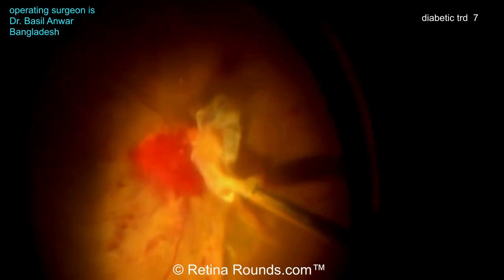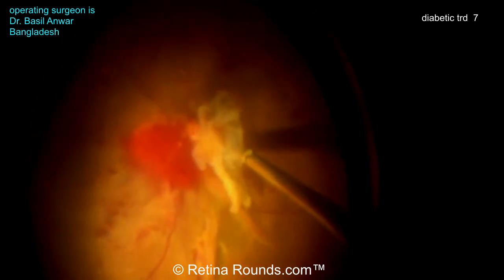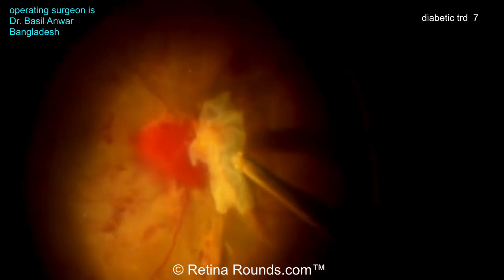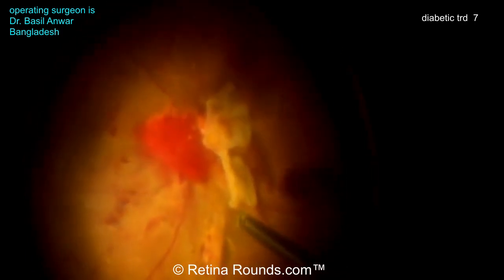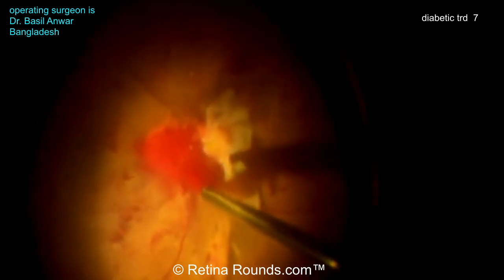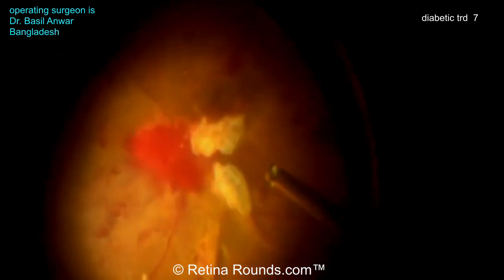Now using the cutter to segment: the membrane is loose in multiple areas, so he's using the cutter to debulk and break it down into smaller pieces. You can actually see the mouth of the cutter underneath that fibrovascular tissue — that's usually a very good sign that you can safely cut in this location. If you can see through a membrane through the cutter, you're probably not engaging retina. He's doing a nice job of using that cutter almost like a hook to get underneath that membrane, identify the space, and then carefully tapping the foot pedal to engage the cutter and segment this membrane into two pieces.